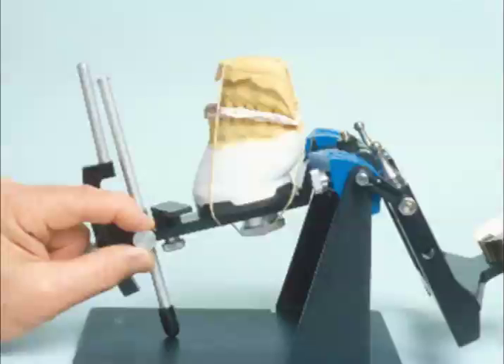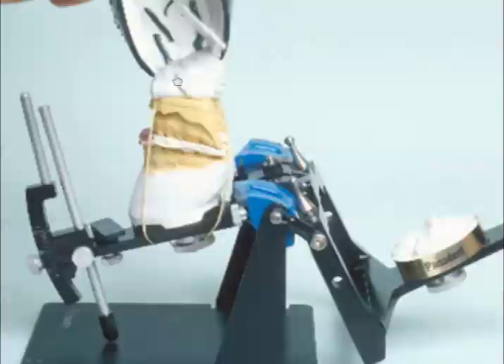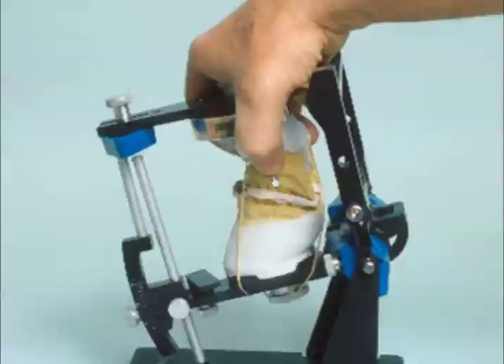We then take the centric relation record and index it to the upper cast, and then index the lower cast into the centric relation record. And we now have the articulator upside down in our mandibular mounting stand. And with the mandibular mounting stand, we can actually adjust the front end of the articulator down so we can level the cast here so that the plaster will stay in place. We can now add plaster to the model and the mounting plate, swinging the lower frame around, making a connection of the lower cast to the lower mounting plate.